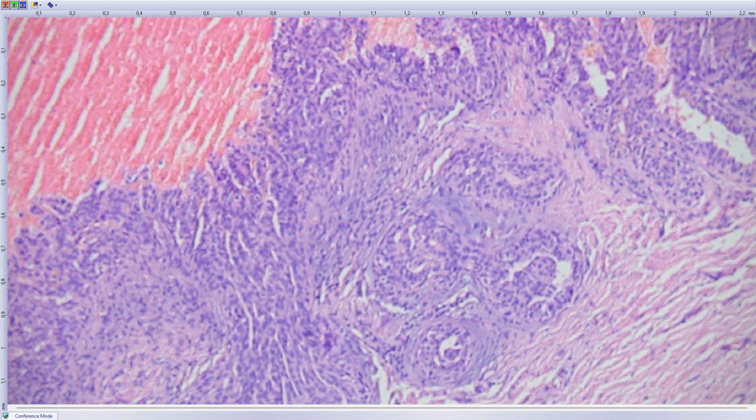I think it's the time. So what is the lesion called? I would call it adenoma arising in anogenital glands. They were described in 1991, so relatively very recently. They were not suspecting that they even exist. Yeah, I will come back in the future to these glands and the whole pathology, because it's entirely new pathology, and without knowing these lesions, no dermatopathologist can diagnose reliably lesions of vulva.